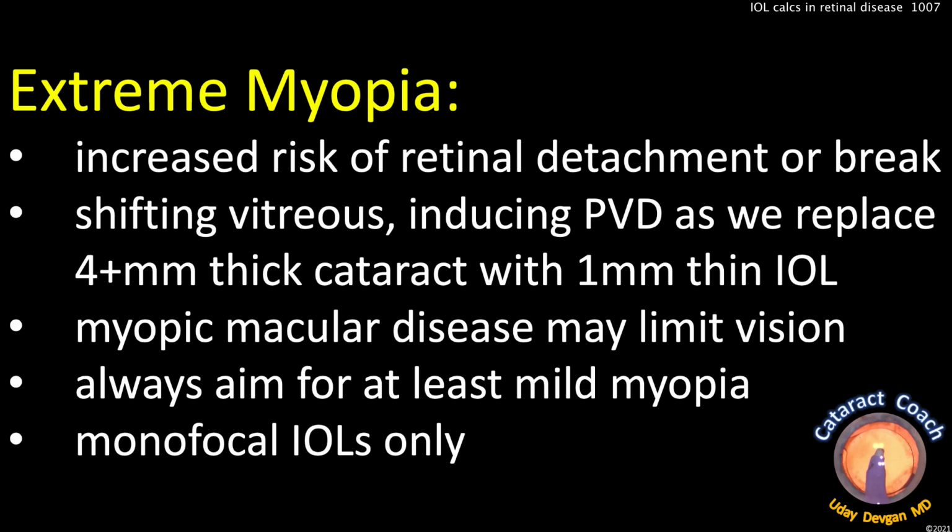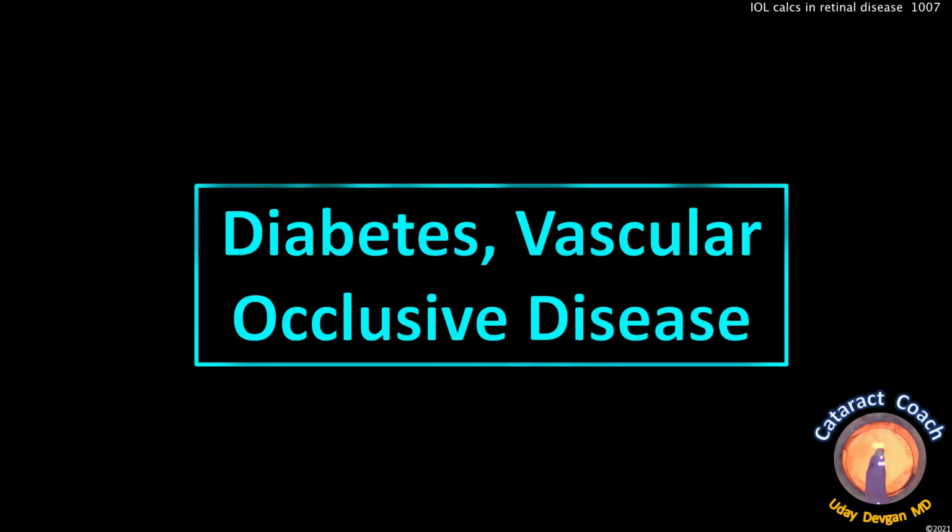The vitreous will shift. We're going to induce a PVD as we replace that thick cataract with a very thin IOL. And myopic macular disease may limit the vision. Always aim for at least mild myopia and monofocal IOLs only.